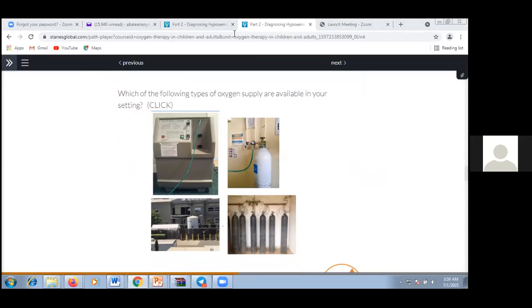Another thing, maybe in our ICU, we started a system where we kept the cylinders in one room and connected them in series, to the manifold, and supplied the beds for our ICU. So this was a system where we still use the cylinders, but it was through the pipeline that we got oxygen to the individual patient.